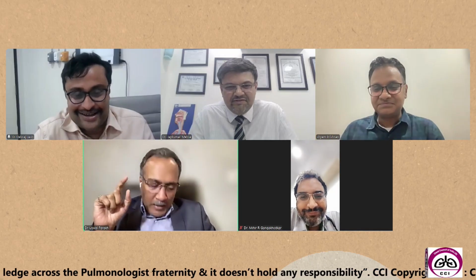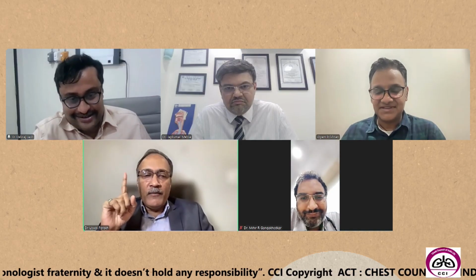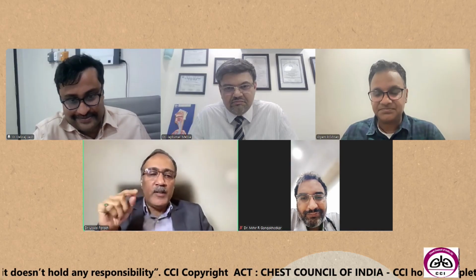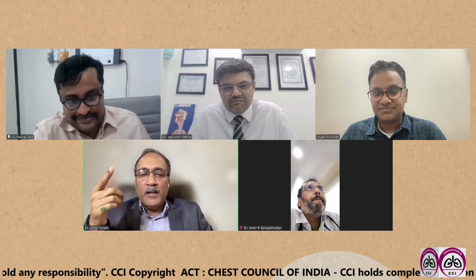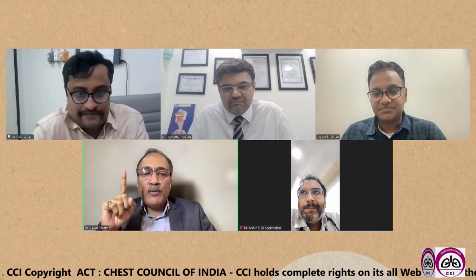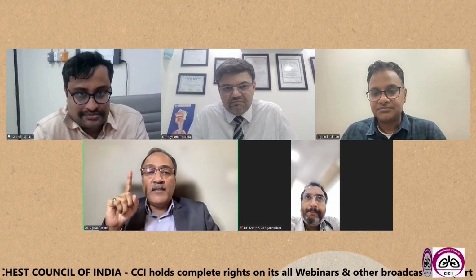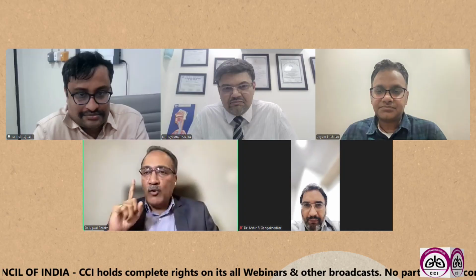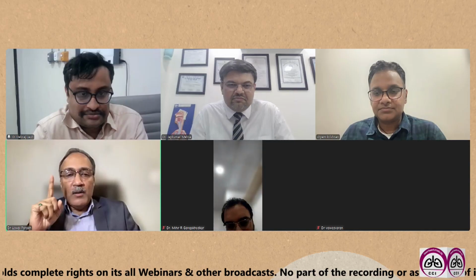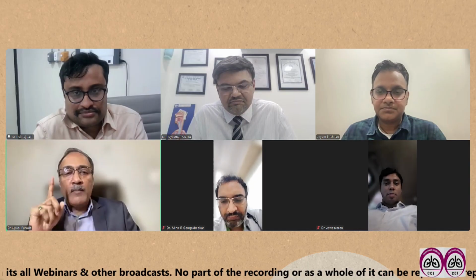Yes, sir. I think the balloon part is something which we should be doing and not leaving for the technician, because technicians are not very careful in doing these things. It is very easy to take out the air if you are a little cautious in the beginning. Number two, the cost of the balloon is around 3,500 per balloon. That is quite a bit, and that is one of the reasons why people are not using it. But it's always advised to use the balloon, because you never know when the problem is going to come. So Vishwesh has rightly said, the balloon itself is enough to control any kind of normal bleeding which happens.